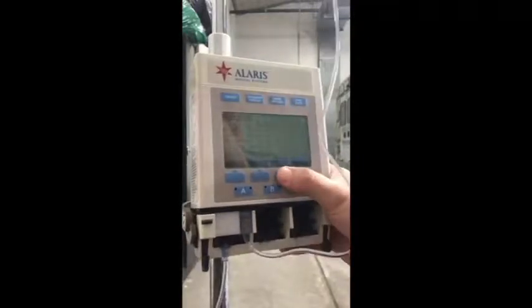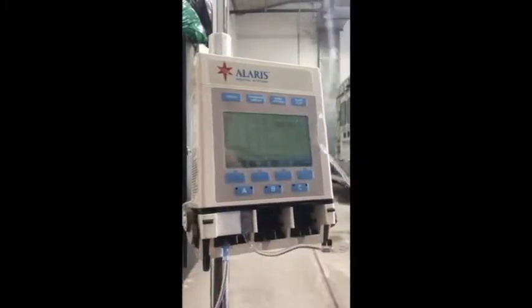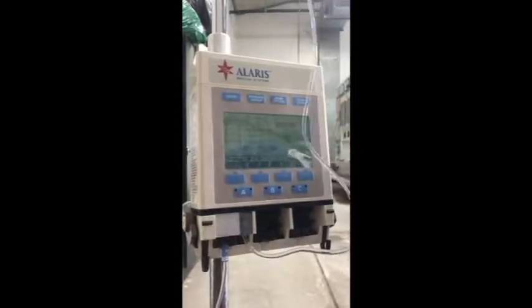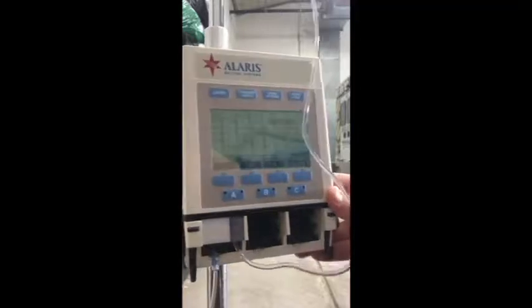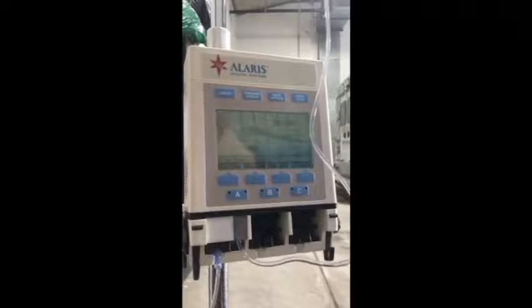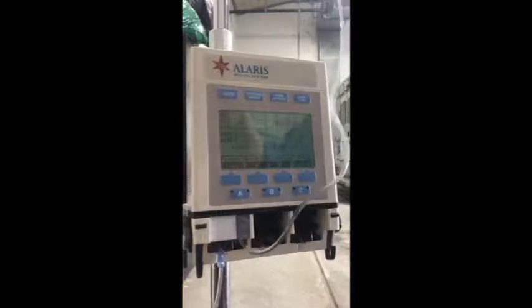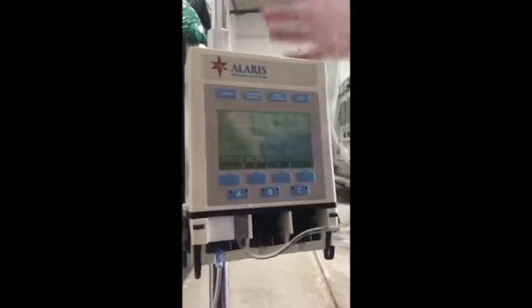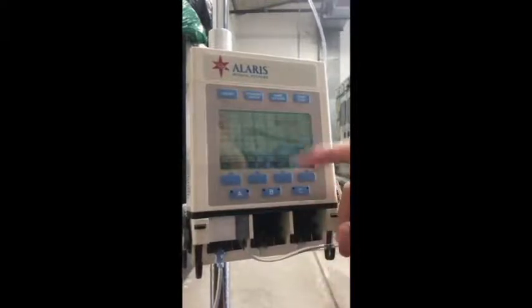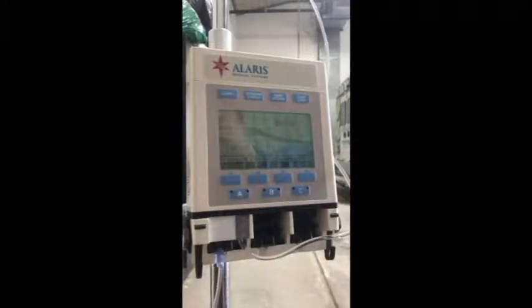So let's try clearing the air. And that looked like it did it. So now we can go to start. And so I'll hit start. There we can see we have our green light. Everything is good. It's infusing. It says infusing primary, and it's going into the patient.